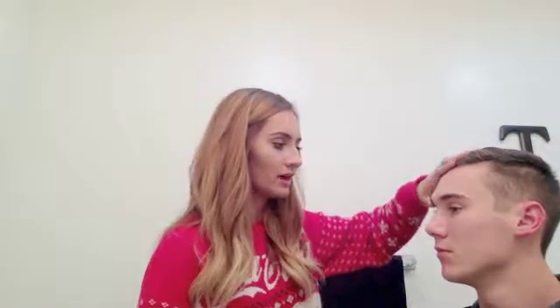If we are examining the patient's right eye, we hold the ophthalmoscope with our right hand and look in with our right eye. Also, you want to hold on to the patient's forehead and lift their eyelid so that you have the best access to view the optic disc. All right, I'm going to go ahead and look at the back of your eye. I'm going to shine this light into your eye, okay?